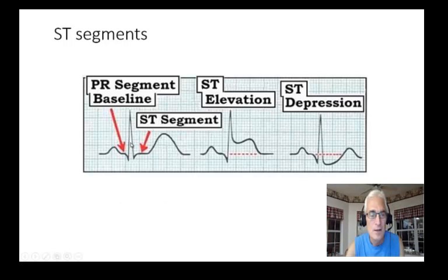Next up, ST segments. Again, there's the P-wave. The P comes to the QRS. Then the S to the T is the ST segment. How do you determine what's normal? See this red arrow pointing to the PR? The PR segment is the baseline, or what we call the P-Q junction. That line between the P and the Q is called the baseline. The ST segment should be at that same level. If it's a millimeter up, that's ST elevation. Millimeter down, ST depression.